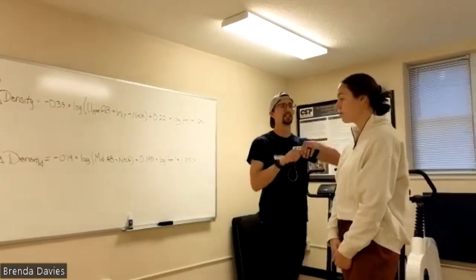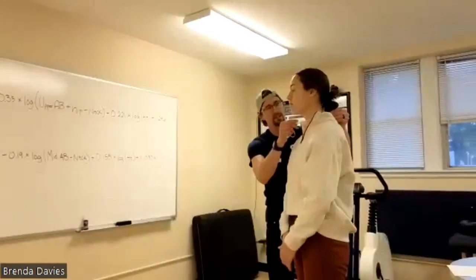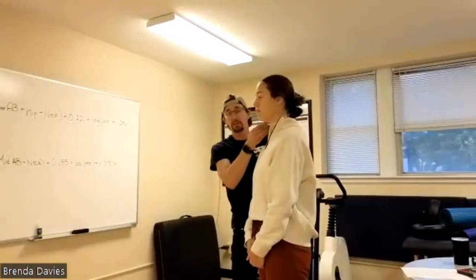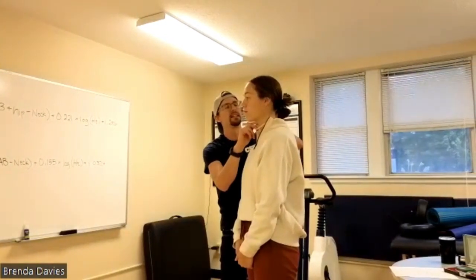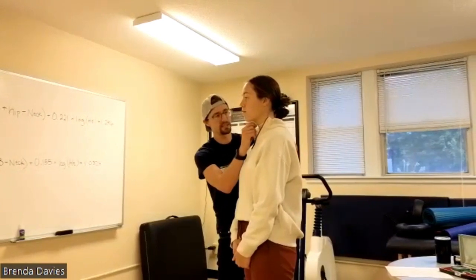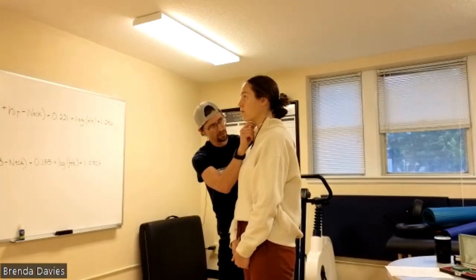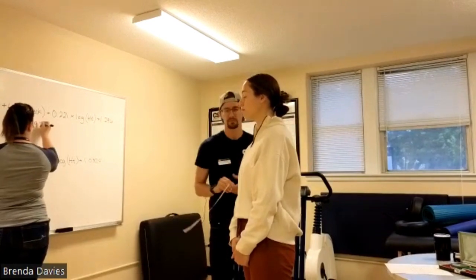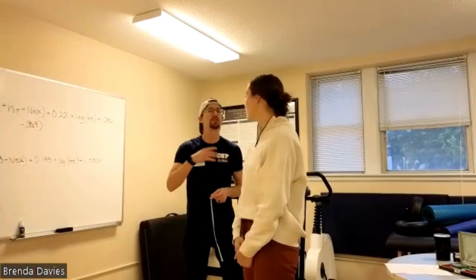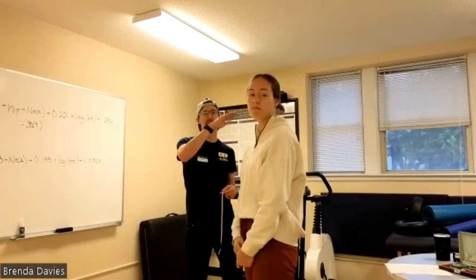So the first one is going to be around the neck. You want it to be a slight horizontal measure. You don't want to obviously choke the person, so having a light enough tension on this that you're up against the skin, but not compressing that skin too much. So we are at 30.9. Okay, so that's going to be the first one. You take multiple measures at each site typically, but you work from top to bottom.